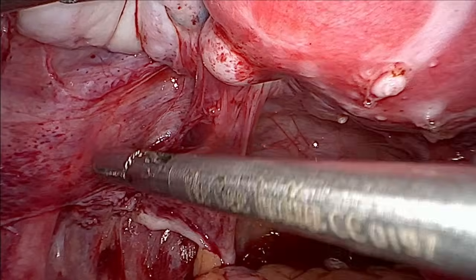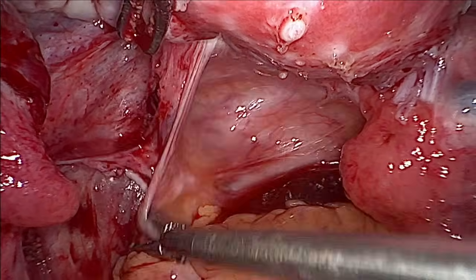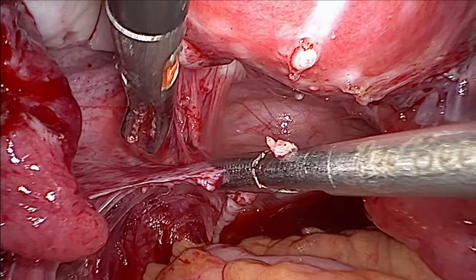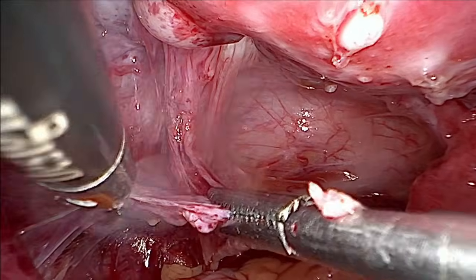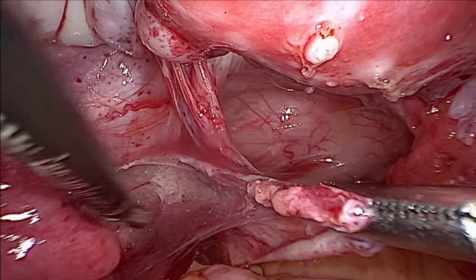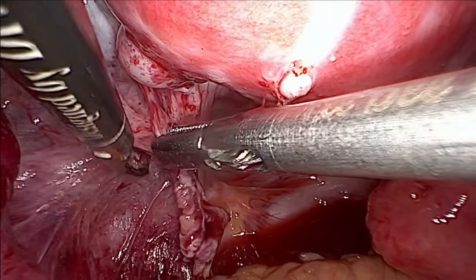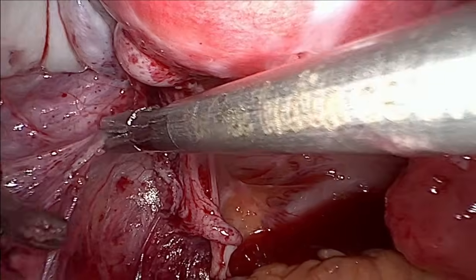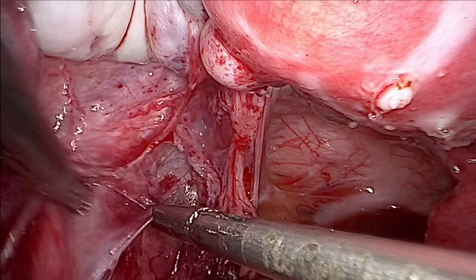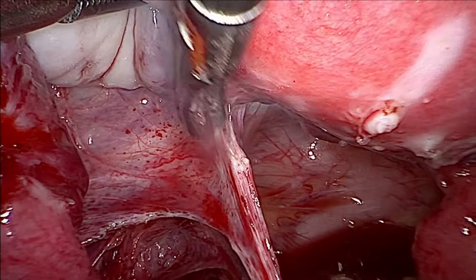Now there are two things. We know the ureter is going like this, and we have also separated this, the intestine here. So you can safely go here. You can cut this peritoneum, cut and dissect, cut and dissect. Again I will once more have a look at the ureter. The ureter is quite lateral. I can safely go and remove this peritoneum.